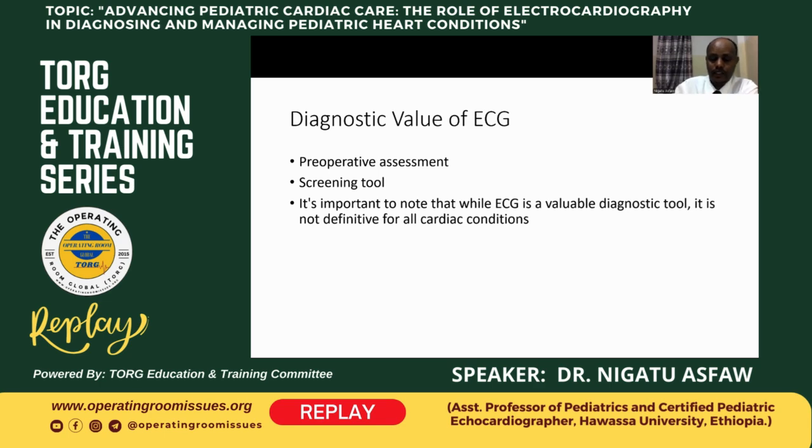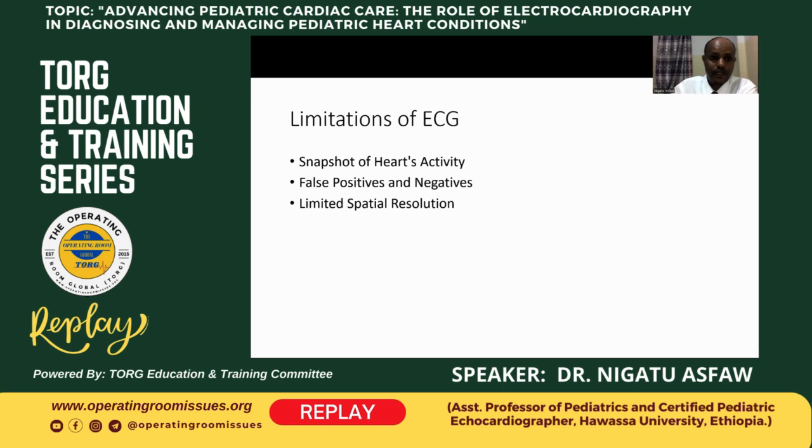And this ECG should be complemented by other investigation tools in order to reach a conclusive diagnosis of some cardiac abnormalities, as this is a snapshot of heart activity. There may also be false positive or negative ECG patterns from different factors.